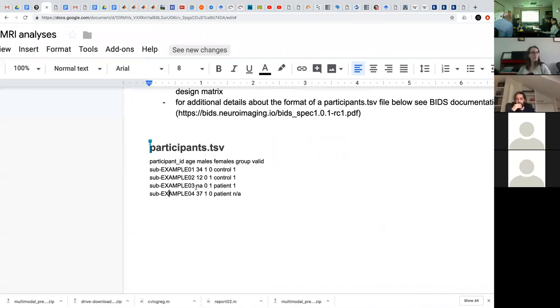If you were to create, say, a MATLAB structure that just had this information, can you just fill in the fields and generate the TSV file from that?